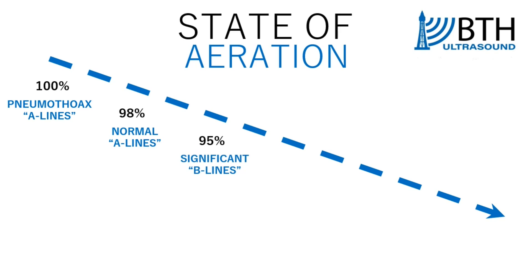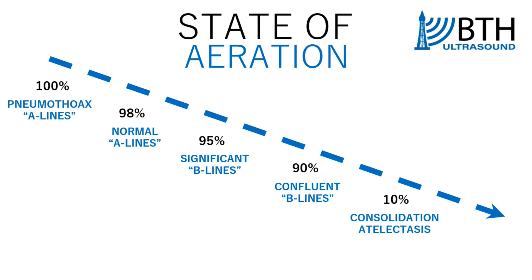As we head down the scale, you get less and less aeration of the lungs and more and more density as either air is removed or fluid starts to infiltrate into the lungs. So you start to get significant B lines through to confluent B lines through to a full consolidation, which could be pneumonic or potentially atelectasis, and then down to a pleural effusion where all of the air has basically been removed from the lung tissue.